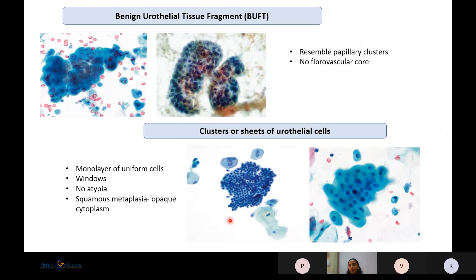Clusters or sheets of urothelial cells resemble true tissue fragments but, if we look closely, they are monolayer sheets with presence of windows — this distinguishes them from true tissue fragments. There is no atypia and no nuclear hyperchromasia. Cytoplasm may appear opaque due to squamous metaplasia, but the nuclei are benign-looking, so these are placed in the Negative for High-Grade Urothelial Carcinoma category.